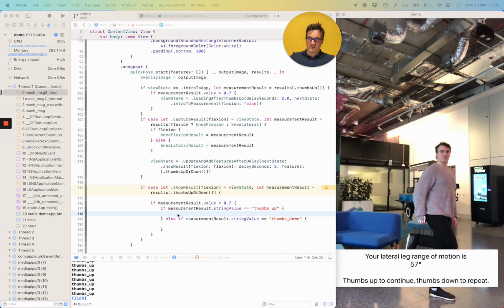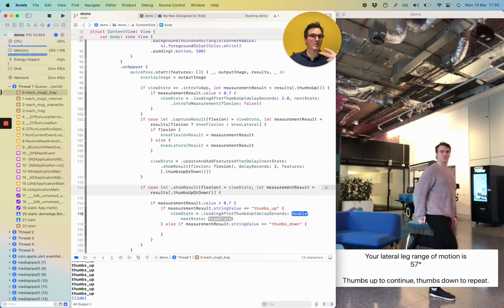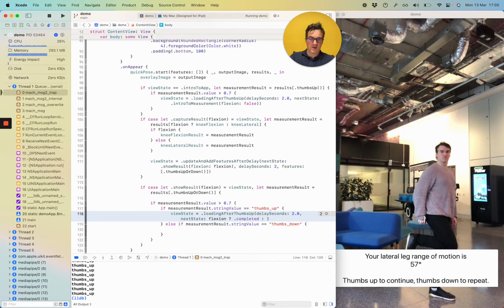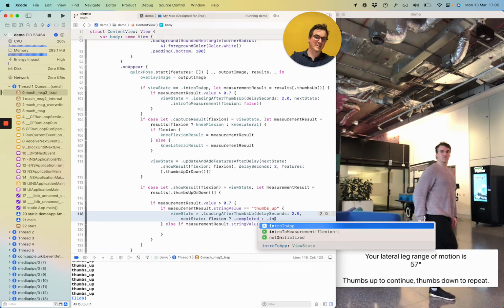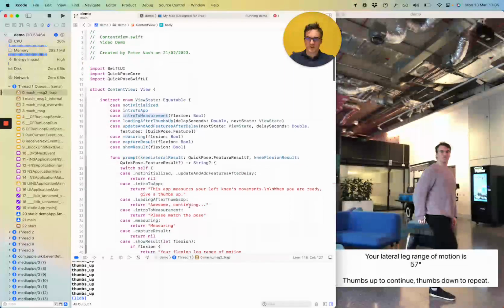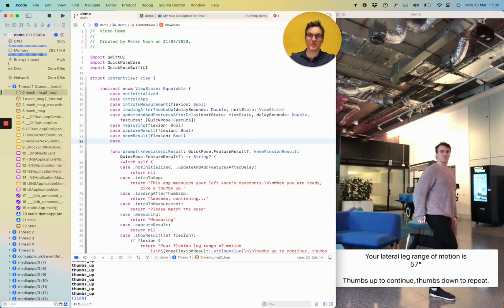So when we've got a thumbs up and we're seeing the results stage, we want to go on to introducing the next measurement. But because this is after a thumbs up, we're going to give the feedback. So the delay is 2 seconds, absolutely fine default. And depending on if it's the flexion result, then if it is flexion, we want it to jump to a completed state. We don't have that yet. And if it isn't the flexion result, it is the second one, don't forget, we want to go to the flexion result. Okay, so we need a final state here. Completed is when you've done both states.